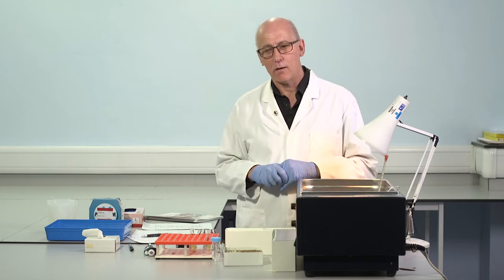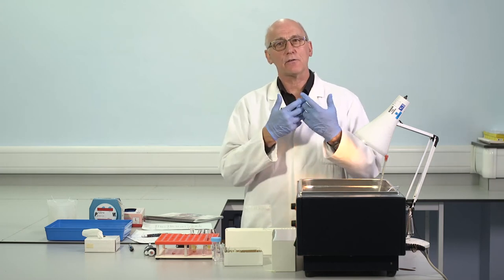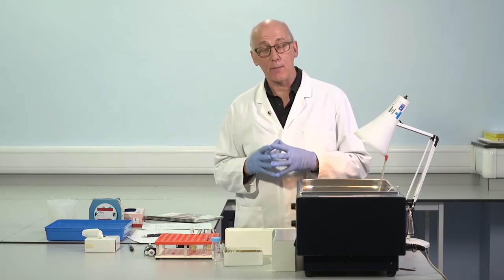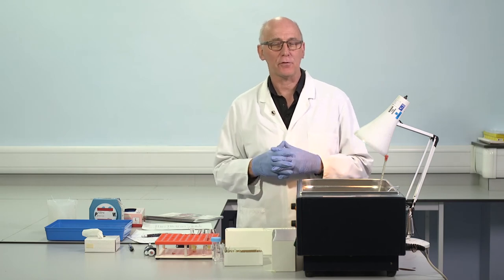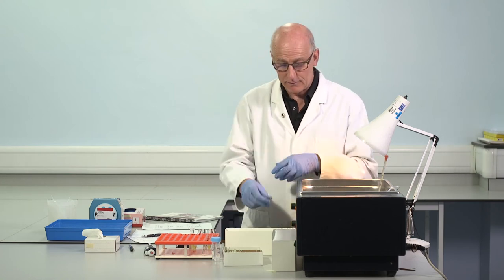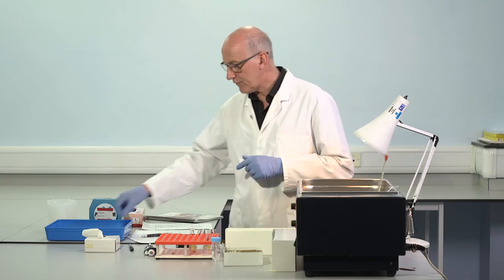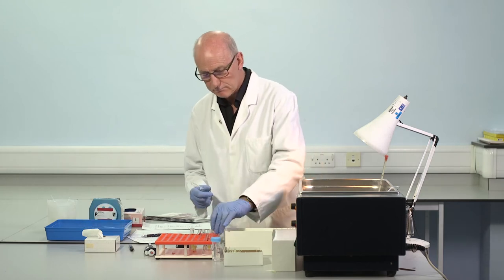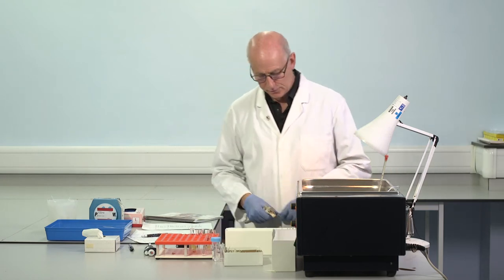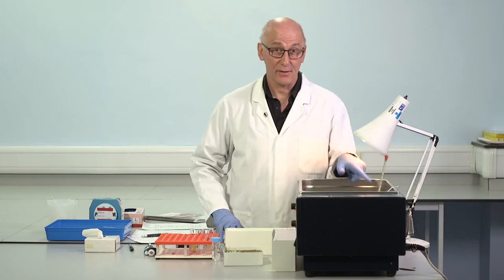Now, back to the 4 test plasmas we've used. We've got some prolonged results. So in order to help us make decisions about which tests to perform next, in terms of expensive, time-consuming specific assays, I think it's useful to make some mixtures and to repeat APTTs. So we'll do that on these now. So we need to make a mixture. I'm going to use plastic tubes for this. Remember, we'll be using 2 shots of 100 microliters. We'll need 200 microliters of the mix to make an APTT.